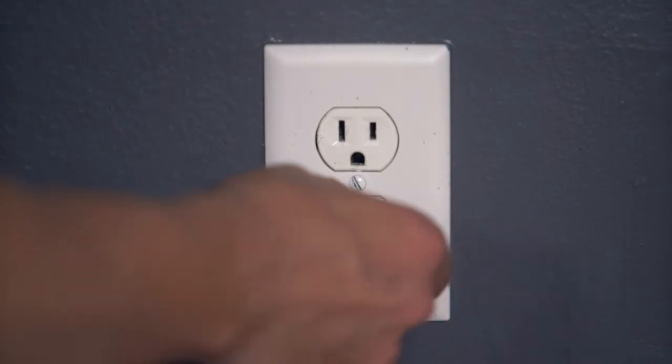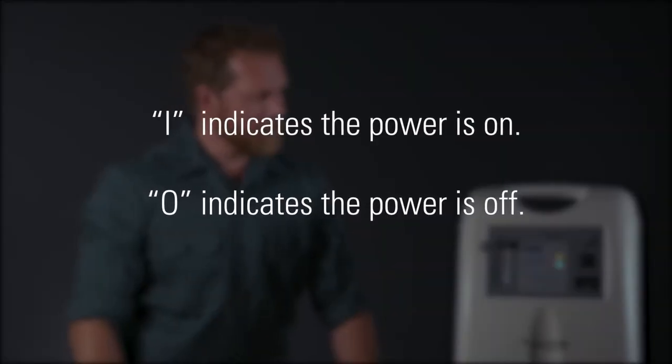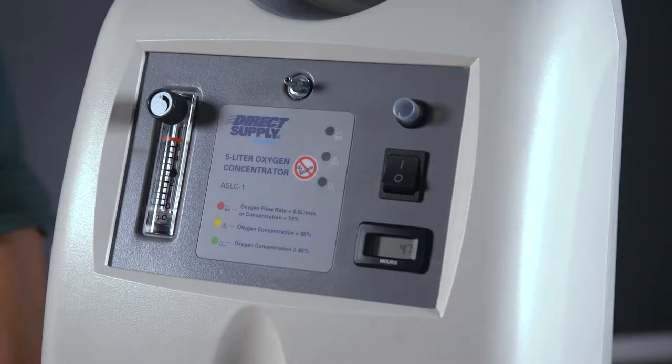Plug the concentrator into a 120-volt grounded AC power source. Turn on the concentrator by pressing the power switch. As the concentrator warms up, the lights on the front will blink in sequence. When only the green light remains lit, your Oxygen Concentrator is ready for use.